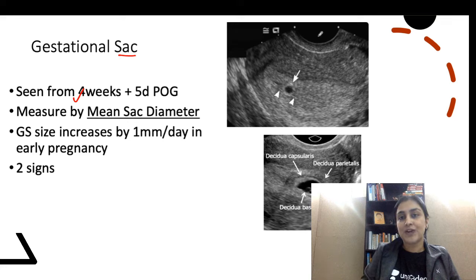This is a transvaginal ultrasound that you are seeing. This is the uterus. Can you see how large it is appearing? The resolution is much higher when we do an endocavitary or a transvaginal sonogram. This is the myometrium, anterior myometrium, posterior myometrium. This hyperechoic thing that you are seeing is the thickened endometrium. And within this endometrial cavity, we are seeing this sac, a fluid containing cystic collection.